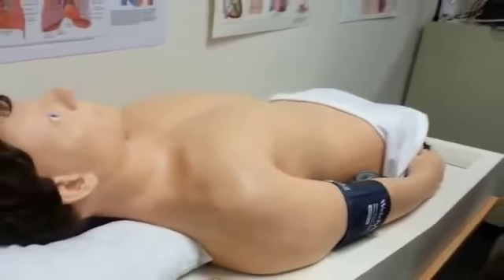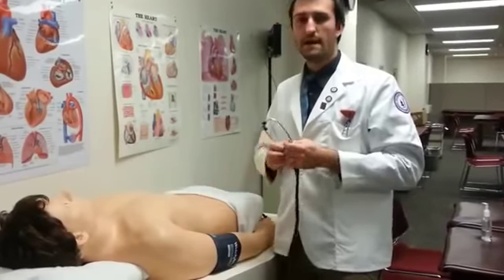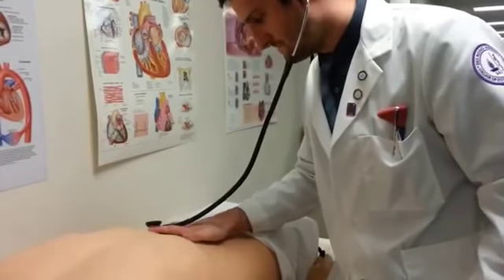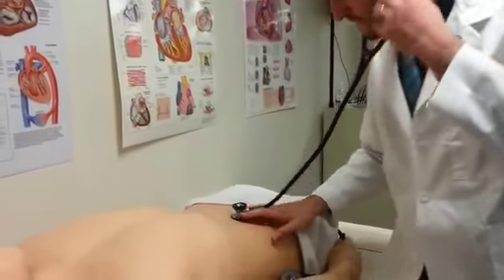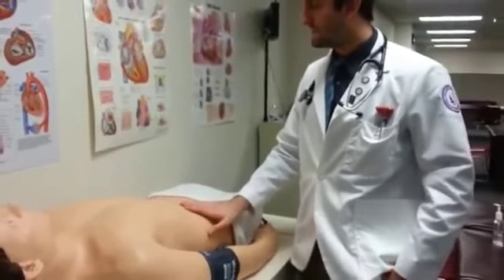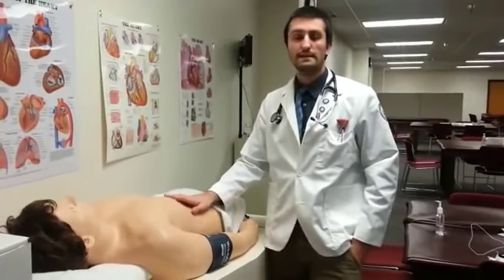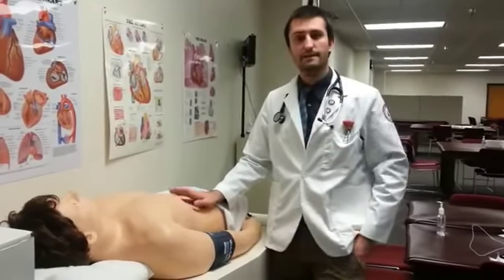Next, I'm going to go on to auscultation. For auscultation, I'll be listening to all four quadrants for active bowel sounds. All bowel sounds are present, which means I can move on. If you did not hear bowel sounds in any of the four quadrants, you would want to hold your stethoscope there for at least five minutes to confirm a diagnosis of a non-working intestine.